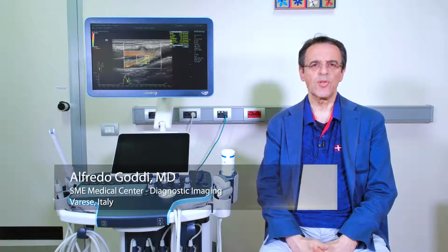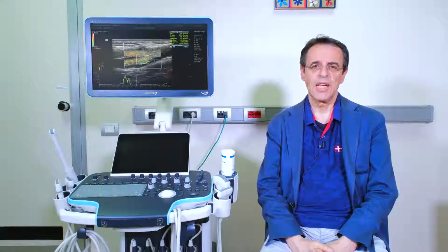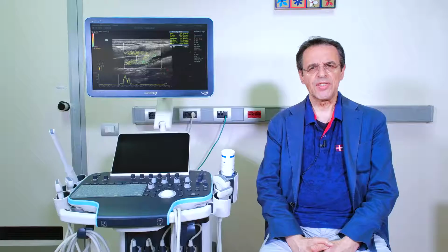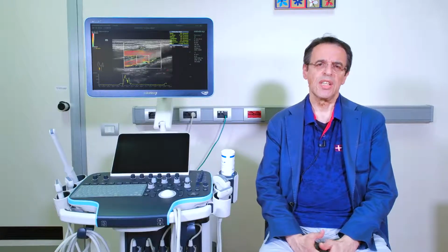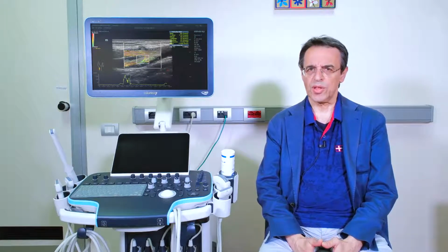I am a radiologist with more than 3 decades of experience in ultrasound. I am the director of the SME Medical Center in Varese, Italy. Over the years, I have focused my research on physical principles of ultrasound, ranging from color Doppler to elastography.